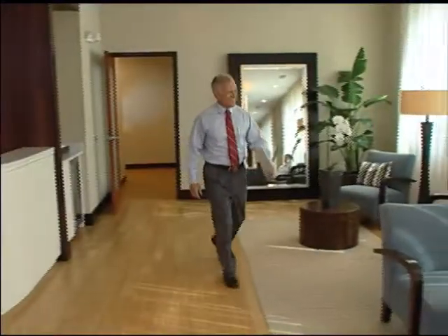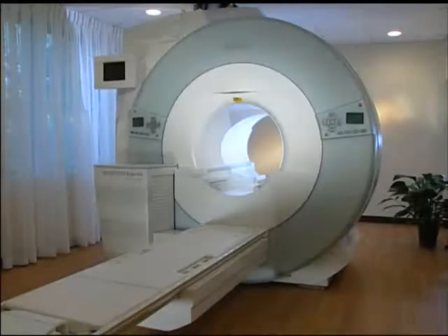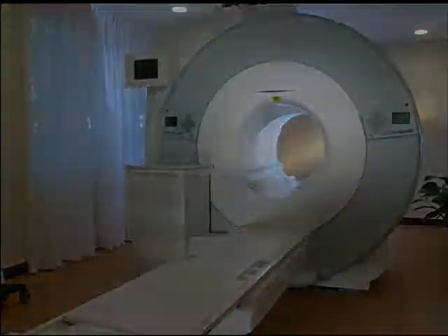Welcome to this MRI patient education videotape. Your physician has ordered an MRI examination. What is MRI? MRI stands for magnetic resonance imaging, and for the next few minutes, we'll discuss the MRI examination.